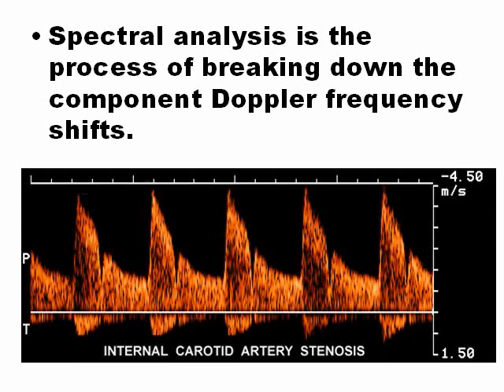Spectral analysis is the mathematics that the machine produces. It's a very complex mathematics, not important for us at this moment. This is how the machine processes the information. Spectral analysis.